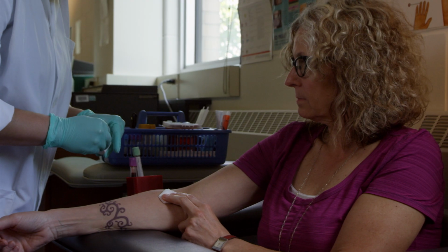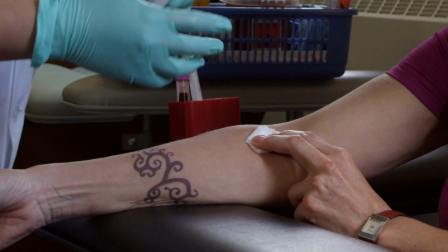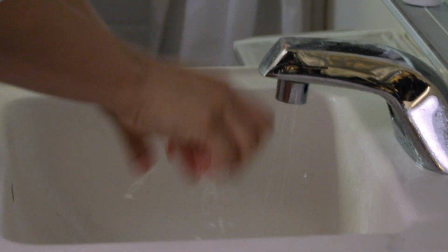The phlebotomist will check to ensure that the bleeding has stopped and bandage your arm. He or she will check to ensure you're comfortable, remove their gloves and wash their hands.